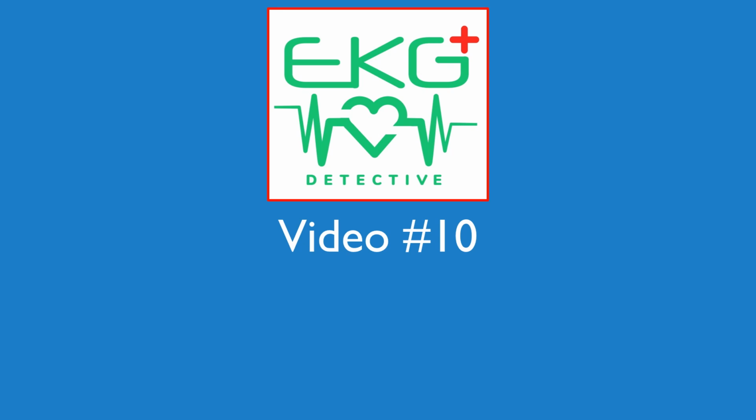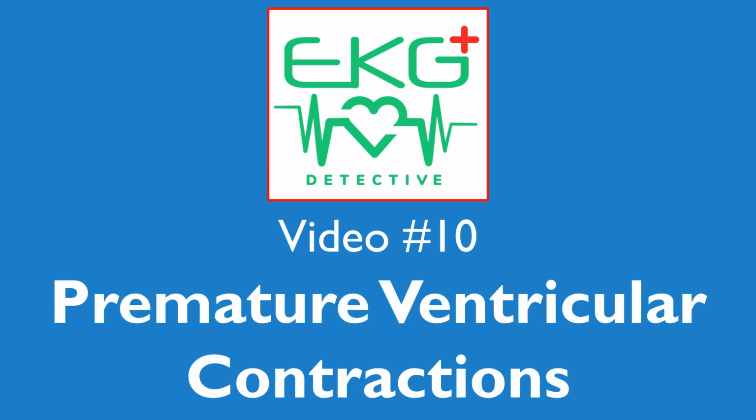Welcome to video 10 of the EKG Detective series. This month we will be looking at premature ventricular contractions.